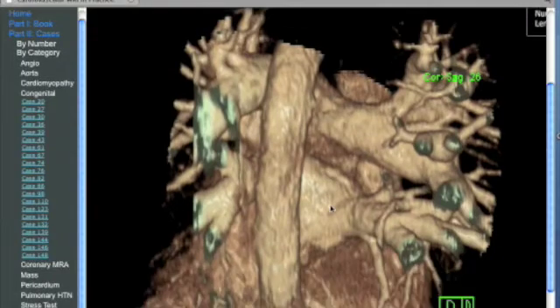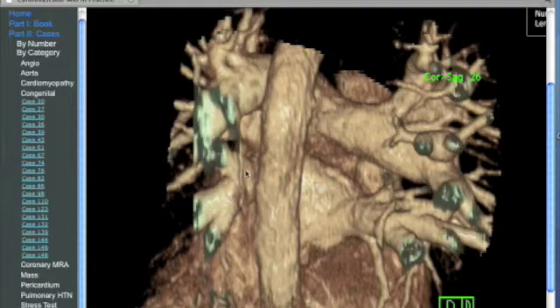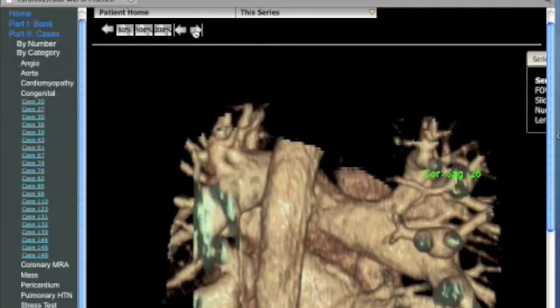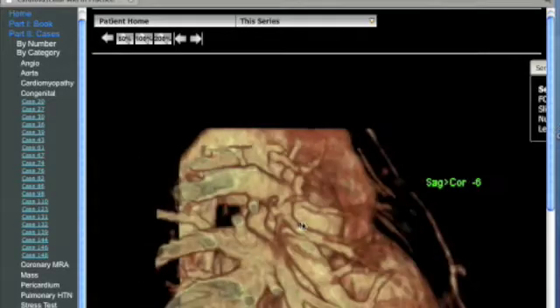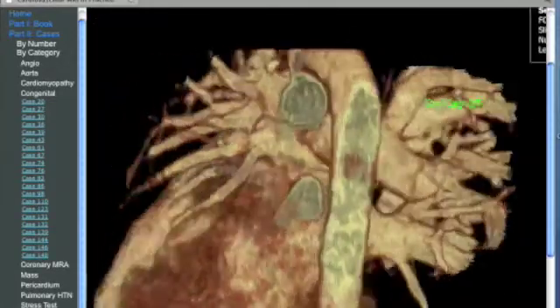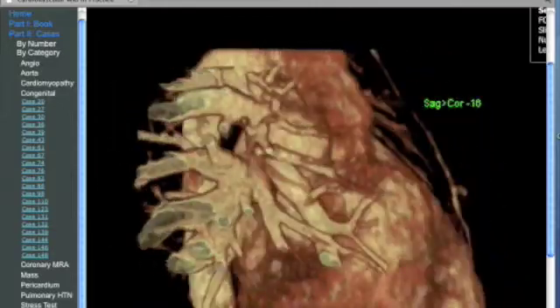A volume rendered image from the posterior margin of the left atrium indicates that the left lower and upper lobe pulmonary veins have a conjoined entrance, while the right lower lobe pulmonary vein inserts into the left atrium, but no right upper lobe pulmonary vein is seen to insert, as it is inserting onto the superior vena cava as previously demonstrated. This is confirmed on the volume rendered images.